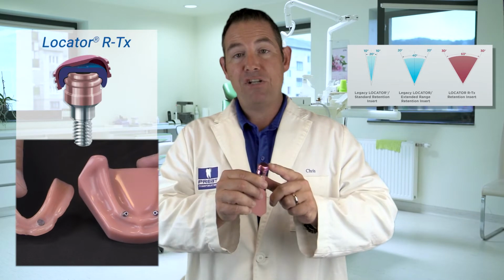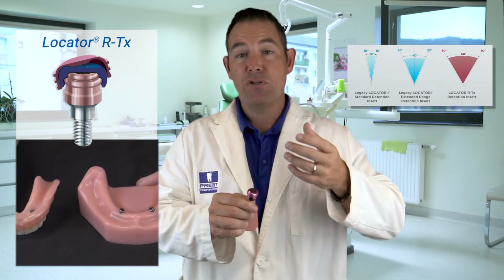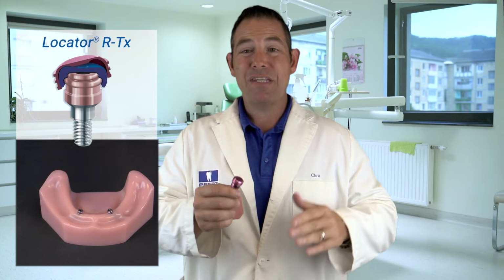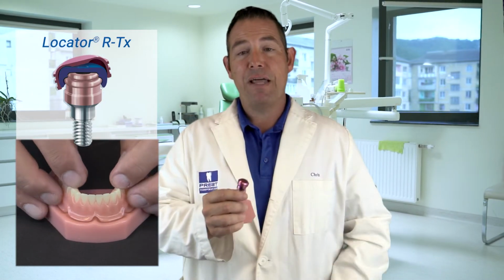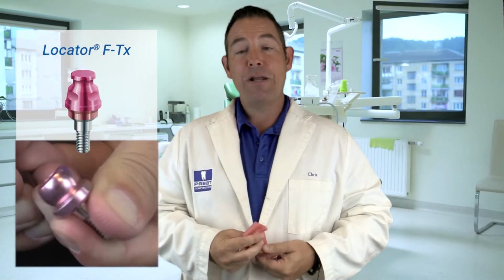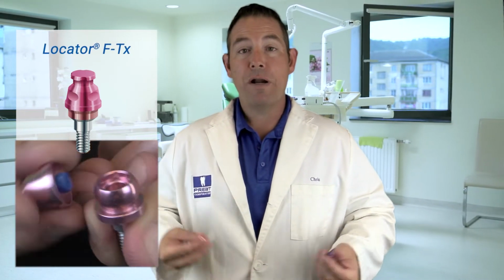It's ideal when a patient has limited dexterity and has a hard time lining up the prosthesis for insertion and removal. Or if it's a case where the patient's really wearing down the abutments because they might be off axis a little bit, this is going to pivot and self-align much better than other systems on the market. That's the RTX.